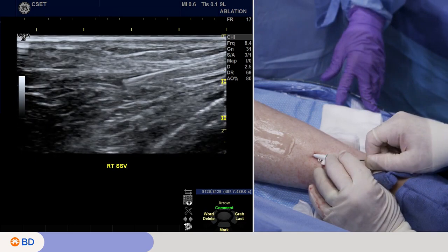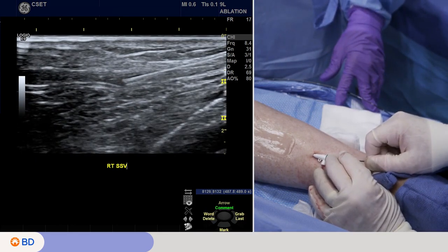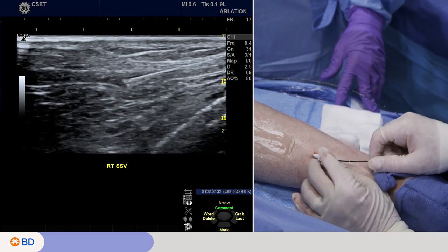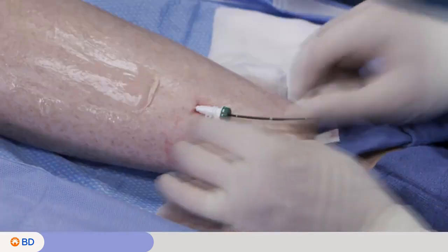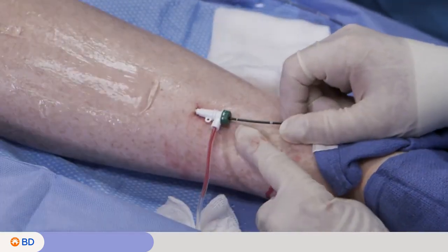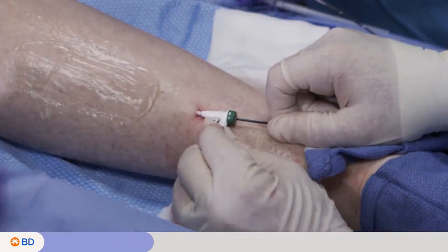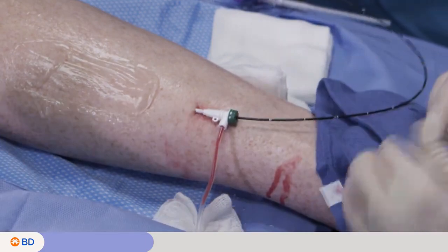One of the tips here is to move and jiggle the catheter gently, and you can prove to yourself and the sonographer that the tip is where you think it is, and we actually have. So this is in perfect position. Once I know it's in position, I like to look at the next marker here, and I will anchor the catheter in my hand and pull the sheath back right to that marker. And then I know that's my start point for my pullbacks.